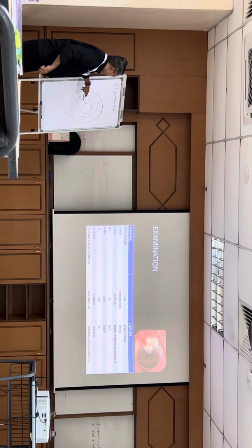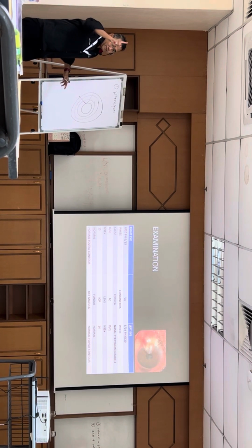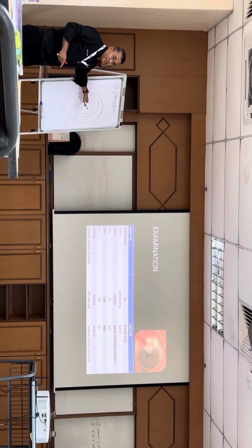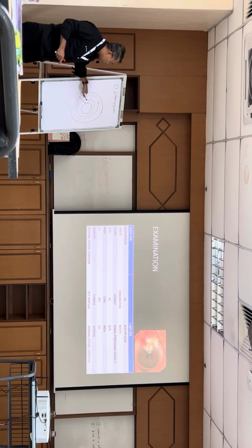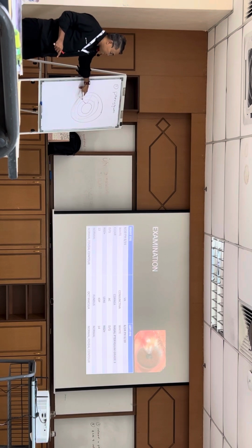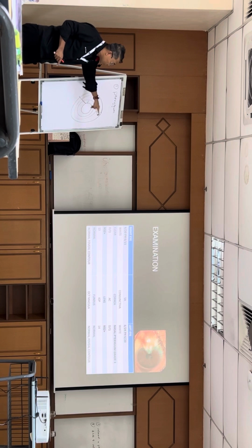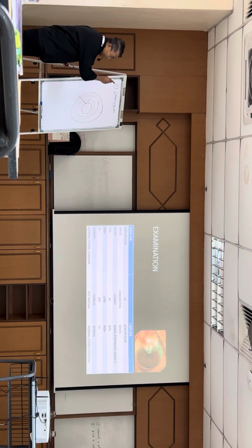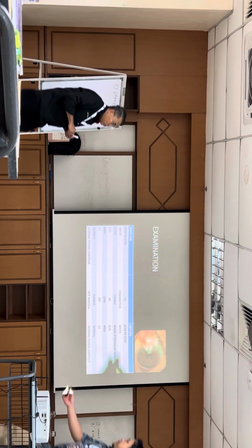So now that's one thing. I want you to see it. As it goes inside, you know that it's approaching the center where you take the K for the IOL calculation. Compared to if you have peripheral, limbal or paracentral, this is actually encroaching to central. That's one thing.